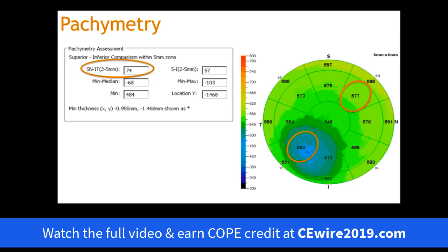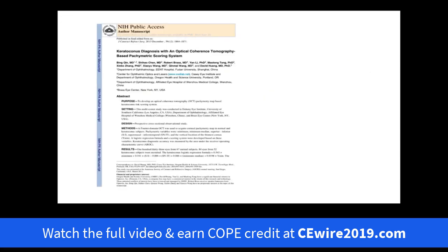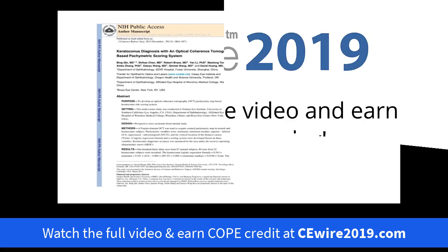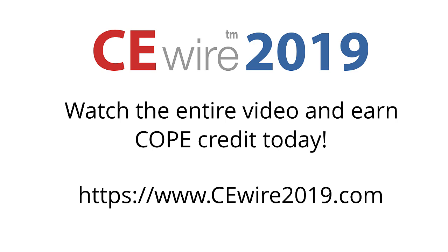As an example, I've circled SN minus IT, which equals 74. SN stands for the superior nasal quadrant of the cornea, and IT stands for the inferior temporal quadrant — and it's simply calculating the difference between those two. These metrics are important because about six years ago a study was published looking at keratoconus diagnosis with an OCT-based pachymetry scoring system, examining these specific corneal quadrant thickness differences.